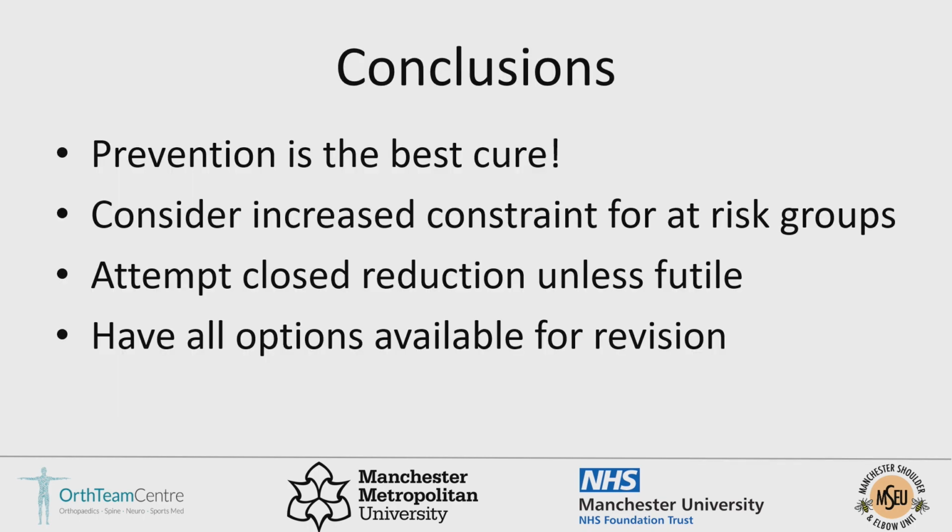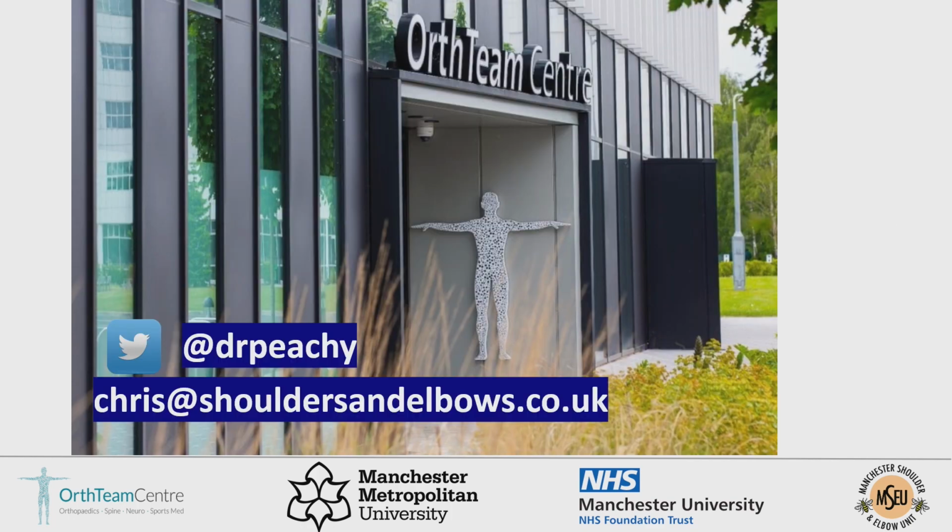So conclusion, we've got to prevent, that's obviously the best cure. Consider increasing the constraint for your at-risk groups in that prevention. Attempt to close reduction unless it's obviously futile, and then have all options available for revision.